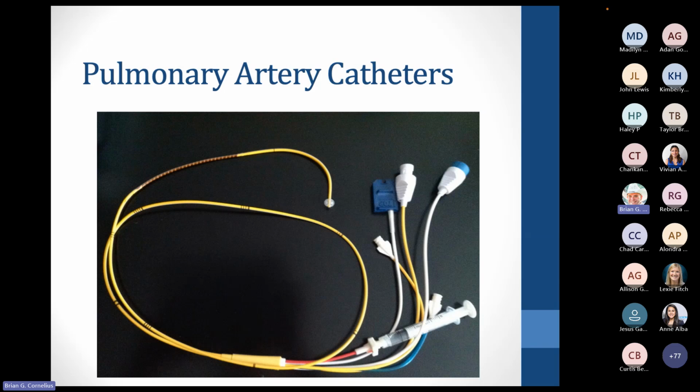Some places are insistent that that syringe stays attached. Other places, to avoid inadvertent inflation, will have them detached. There's also a slide lock down there. So if you look at the white thing in front of the syringe, that's a slide lock that helps avoid accidental inflation. You may also use that to lock the air in there. Say, for instance, you're monitoring pressures. You don't want to have to stand there and hold the syringe. So you may inject the air and then lock it in place.